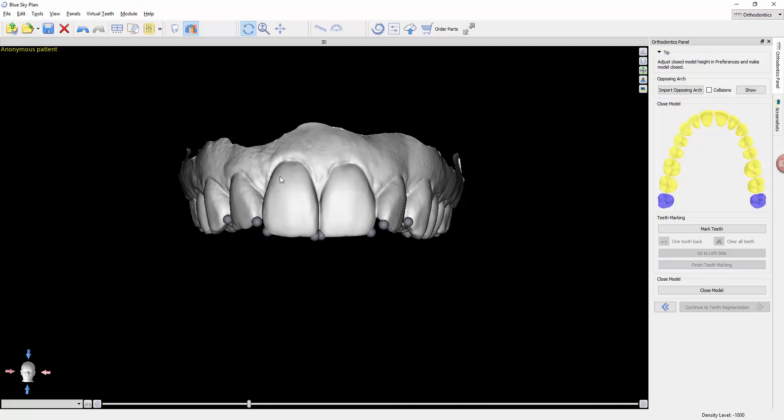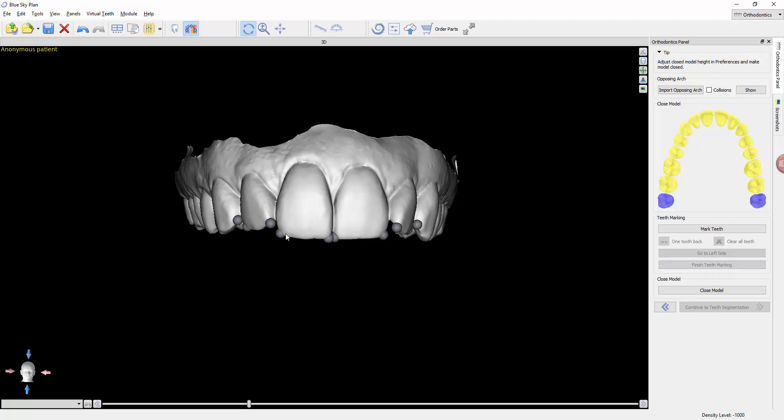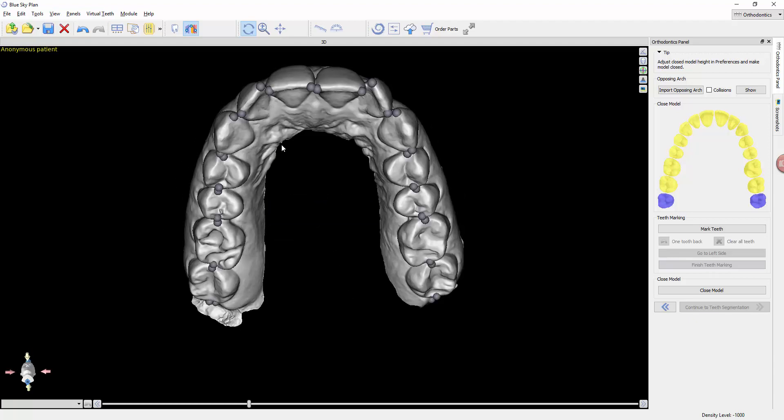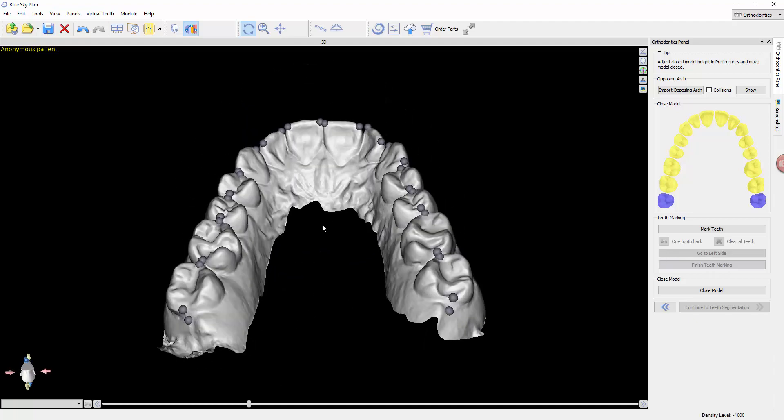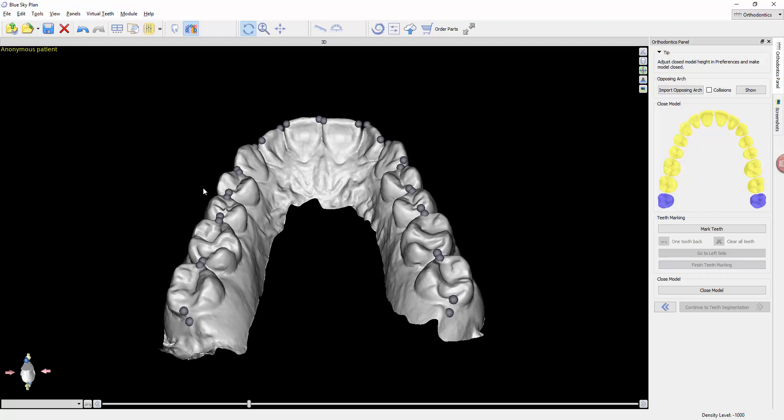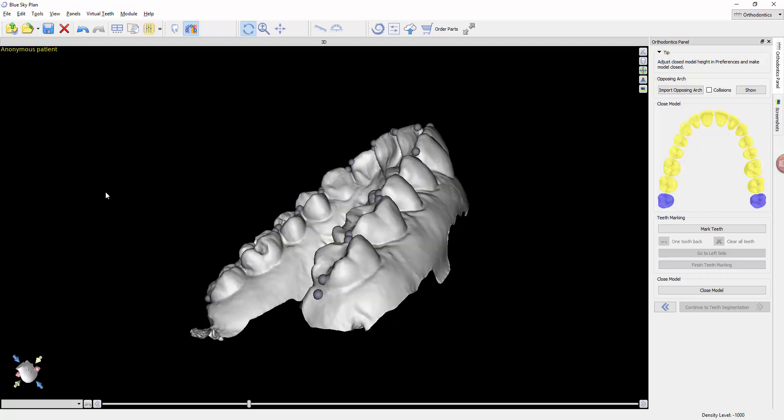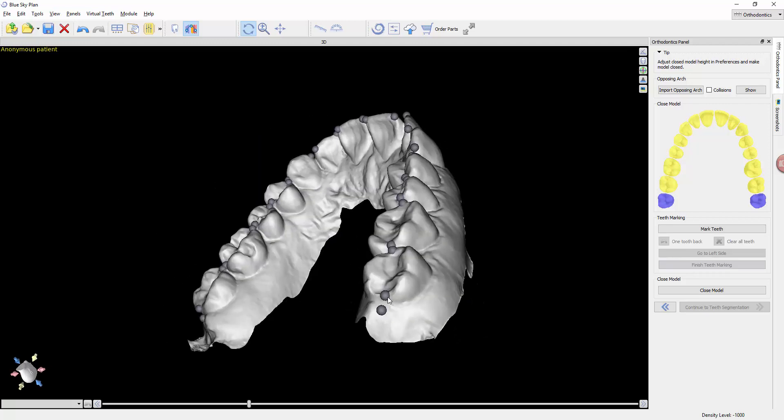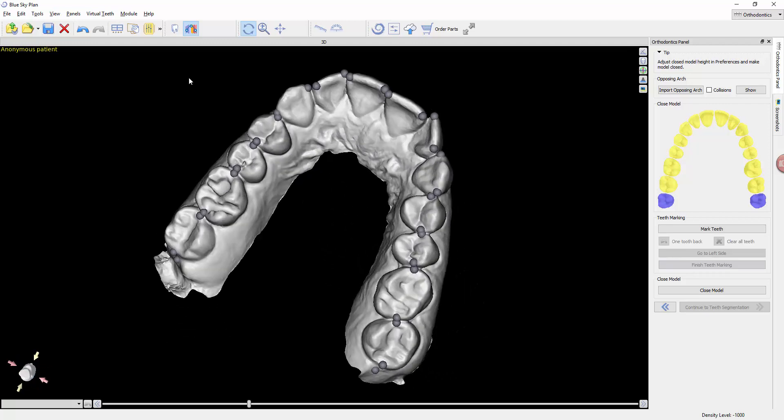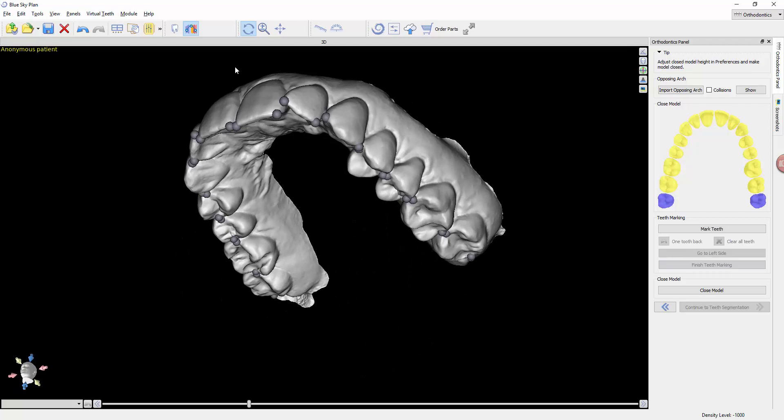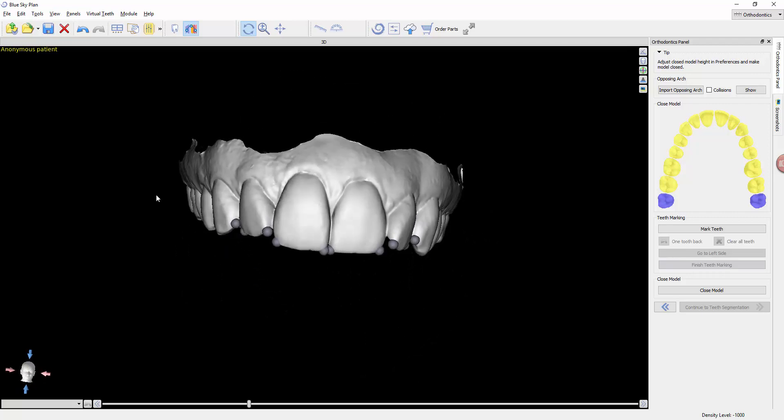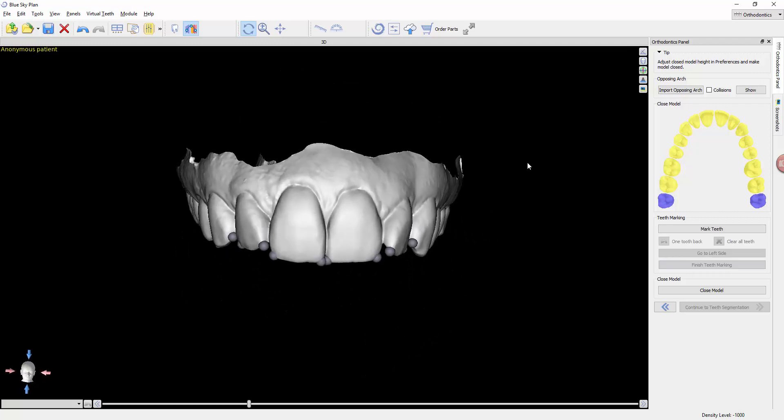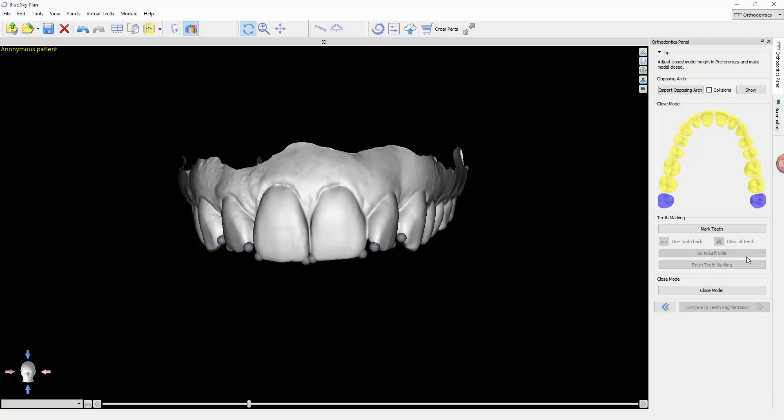There's a little cant here, and I think that's partly due to the actual teeth and the averaging out of these dots. It can also be affected by the placement of the most distal dots in the second molars. But that is how this module works. You have now marked all the teeth. Now the next step is to close the model.